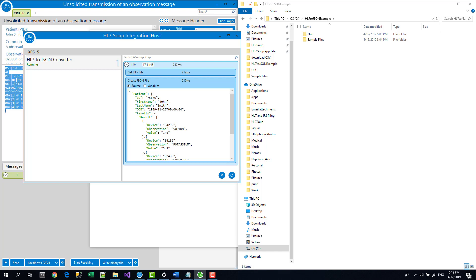So incidentally, this message log that you have here, it shows about the last thousand messages, give or take, and that's useful for diagnosing any problems that you might have.